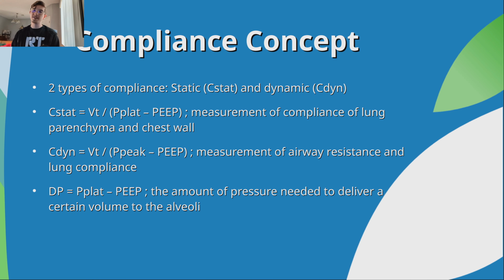So compliance, there are two types of compliance. We have static and dynamic. Typically, if somebody just says compliance without specifying, they're talking about static compliance in general, as that one is kind of more, I'm not going to say more important, but it's possibly the more important one. So static compliance is your tidal volume divided by plateau minus PEEP. This is a measure of the compliance of the lung parenchyma and chest wall.